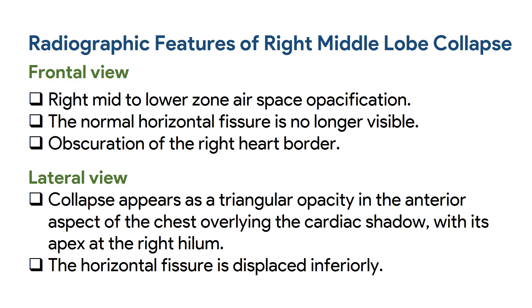Now let's discuss the radiographic features of right middle lobe collapse. The frontal view usually shows right mid to lower zone airspace opacification. The normal horizontal fissure is no longer visible.